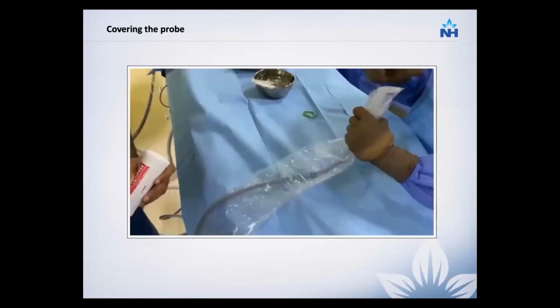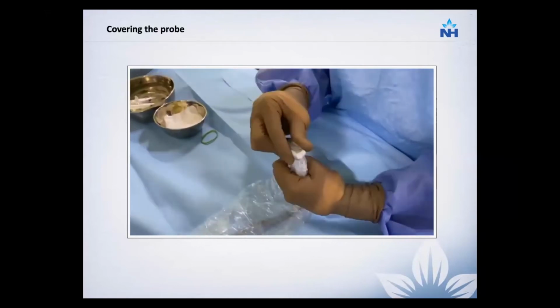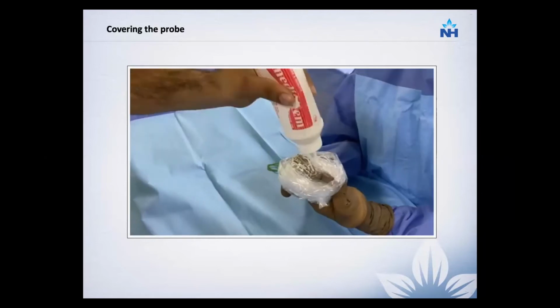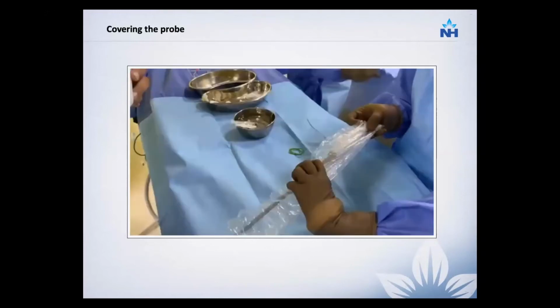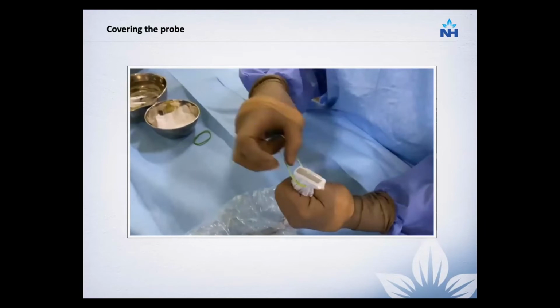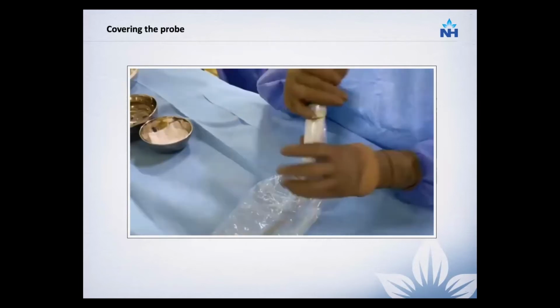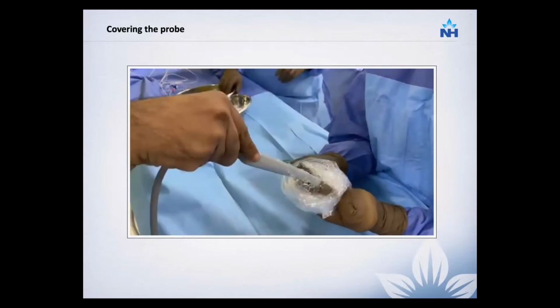And now securing is also very important because we need to get the edges of the probe right, since we have to actually find the center of the probe to puncture. And if there are any loose plastic edges, then the needle might actually pierce the plastic before entering the skin, and again the sterility will be challenged. There should not be any air bubbles in the jelly, because again the imaging becomes very obscure if there are any air bubbles, and a nice, generous layer of jelly should be over the probe. This step is the most crucial, I think, in the whole process, because this is where the imaging clarity is going to come from. So covering the probe is very, very important.